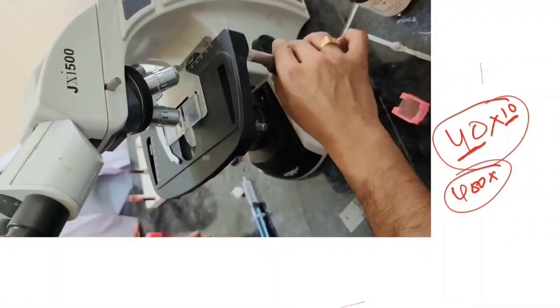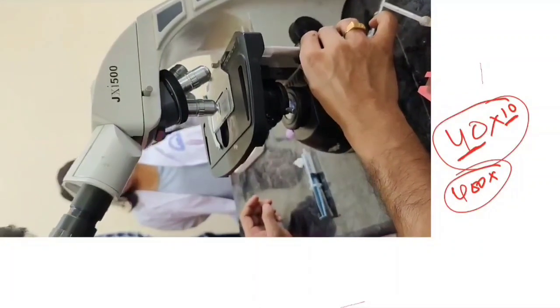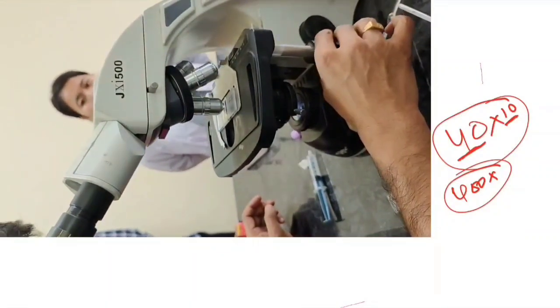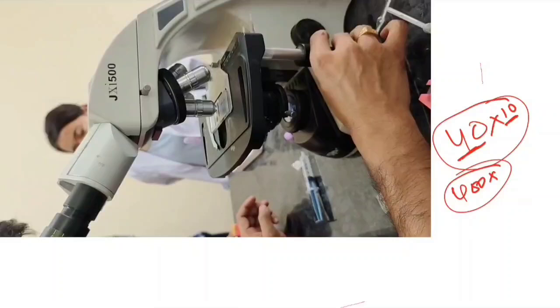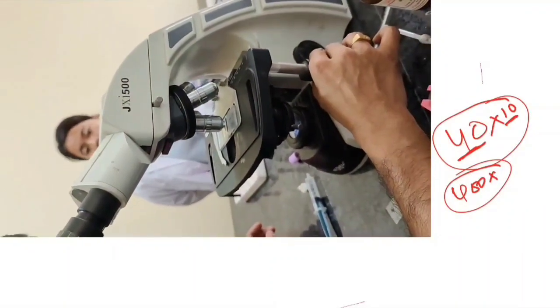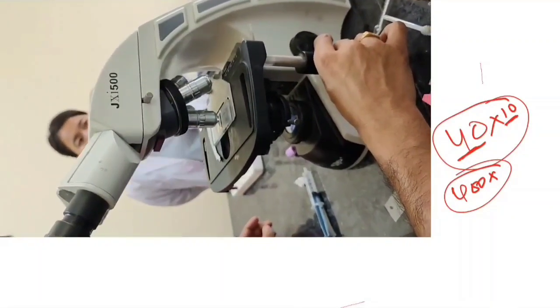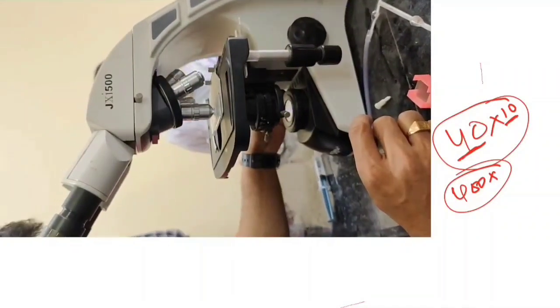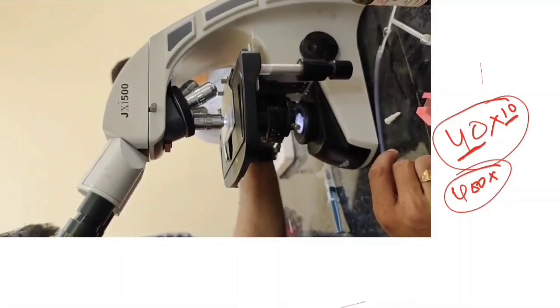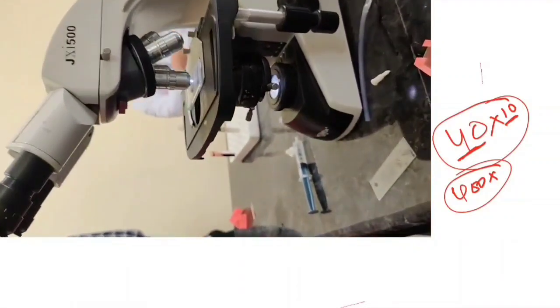So I am moving the slide left and right, or forward and backward, to focus and bring it directly under the microscope. First focus the area, then use the coarse adjustment to see the cell as clearly as possible, and then use fine adjustment to make it clearer. First we should screen the cells with the lower magnification, so the 4x or 10x objective lens we can use, and then finally we will count RBC under the 40x.